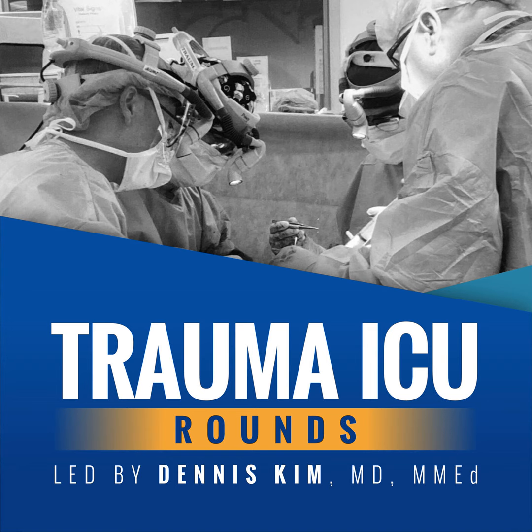The third variable is cycling, and this is the parameter that ends inspiration and initiates the changeover from inspiration to expiration. Cycling really defines how the ventilator recognizes that the inspiratory phase is over. And again, this is something that may be cycled as a result of the flow rate decreasing in patients who are on, let's say, pressure support ventilation, or in someone who's on pressure control ventilation, maybe the inspiratory time has been reached and now the ventilator cycles into expiration.